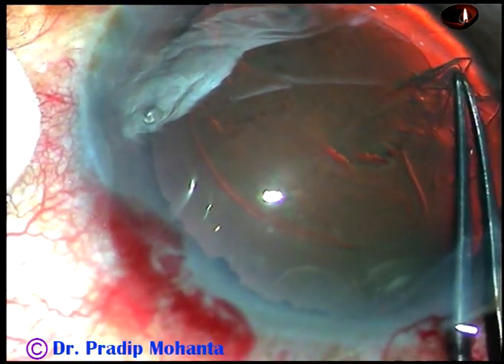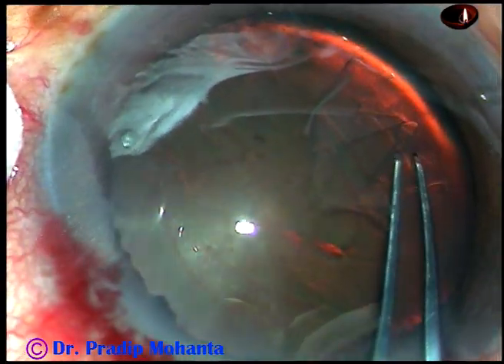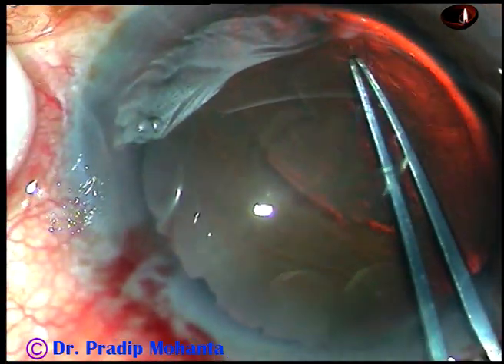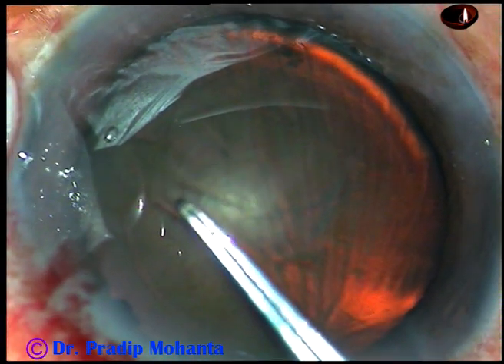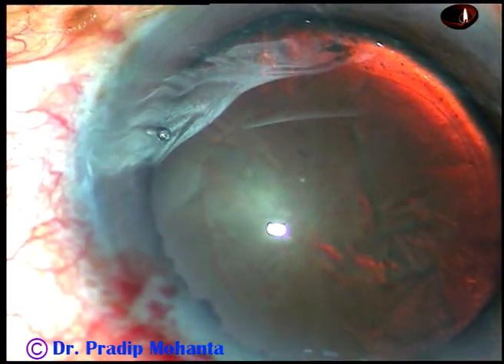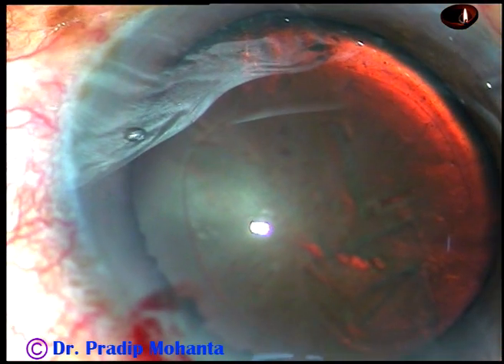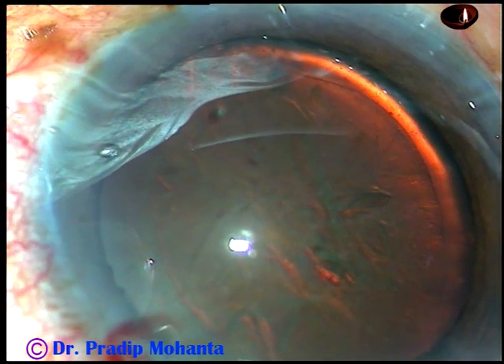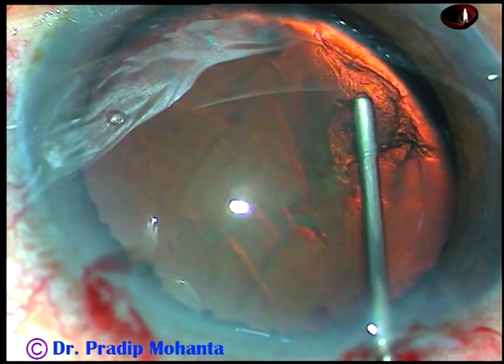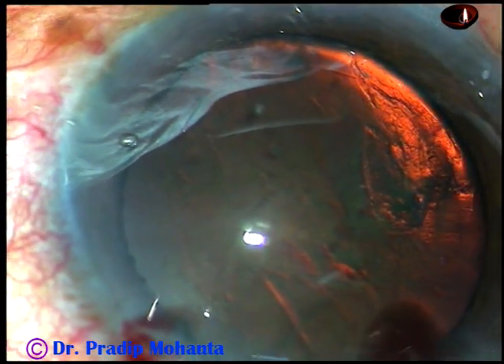Since I saw the cataract is very hard, I tried to do a large rhexis, but I should not have gone so peripherally at this area. However, I could complete the CCC, and now I want to place a capsular tension ring. Hydro-dissection will decrease visibility, so I am going to do dry dissection without any BSS. In this view, we can see subluxation of the cataract for about four clock hours.